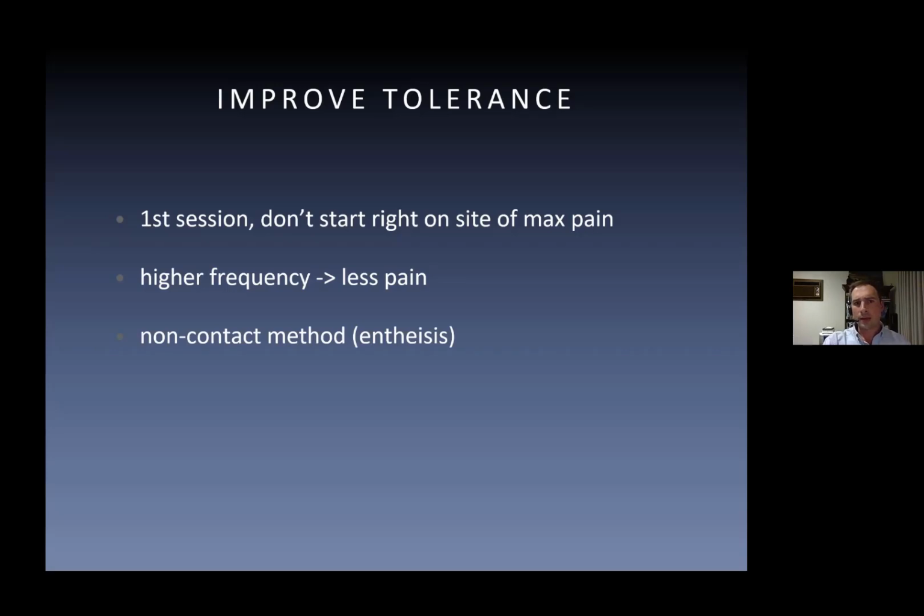When I'm treating around an enthesis, just like an insertion of an Achilles, I do a technique in ultrasound called creating a standoff. It's where you use a big blob of gel. I will apply the shockwave applicator in the gel, but not touching the patient. So I might be holding it 3-4 millimeters off the patient, but it's still sitting within a big blob of gel.